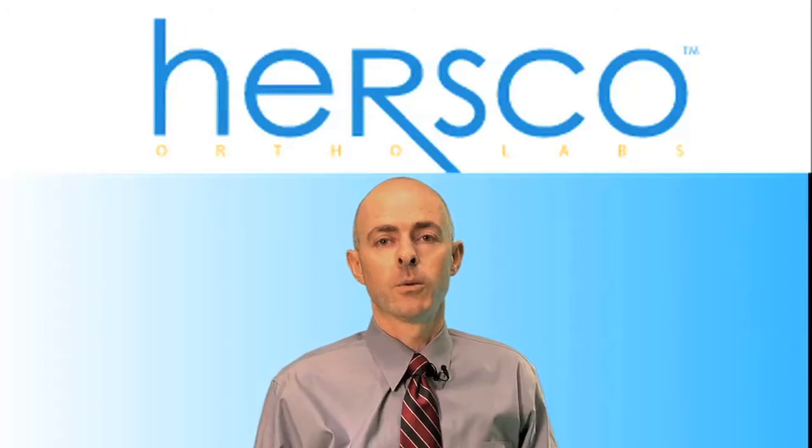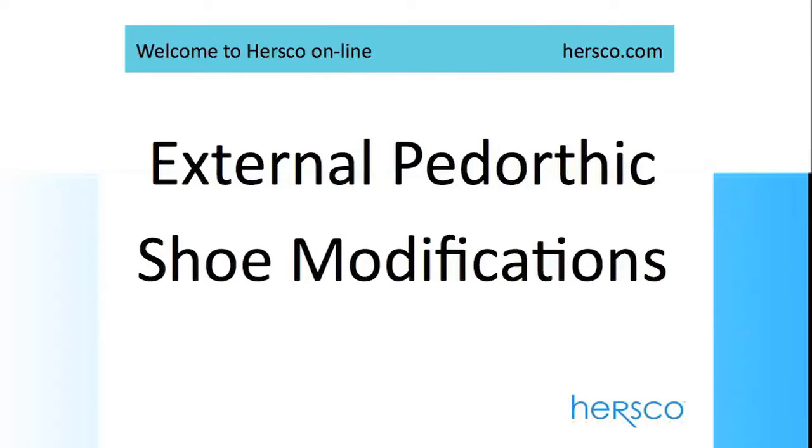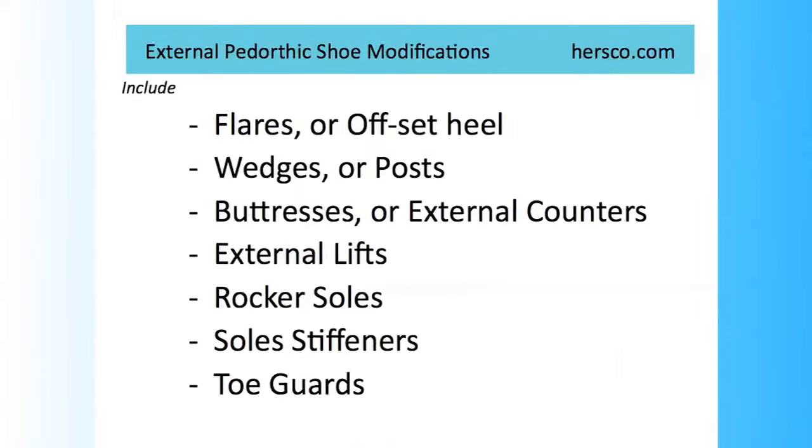In this section, we're going to take a look at external pedorthic shoe modifications. Some of the more common shoe modifications include flares, wedges, postings. So let's take a look at these individually.